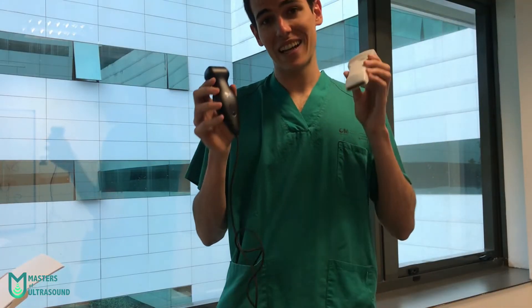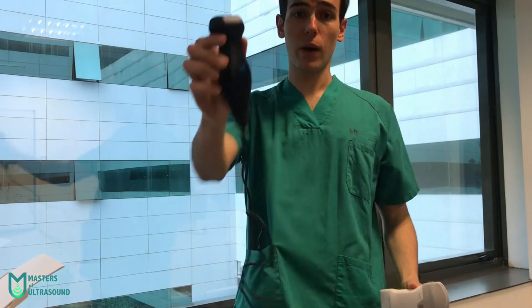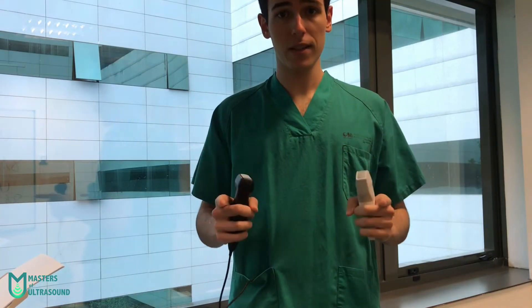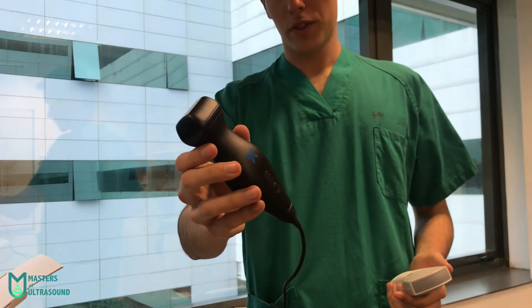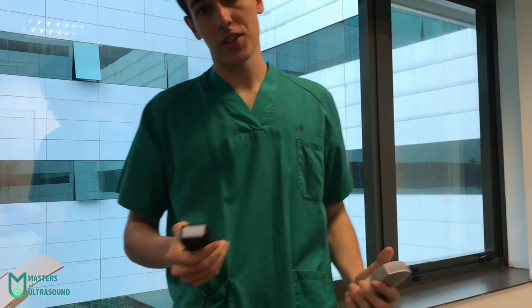Hello again. Today we're going to do a comparison between the new GE Vscan Air and the Butterfly IQ Plus. We recorded the same images with the same patient using both devices, and now you're going to see them side by side. On one side of the screen you'll have the Butterfly IQ Plus, and on the other side you have the Vscan Air images.